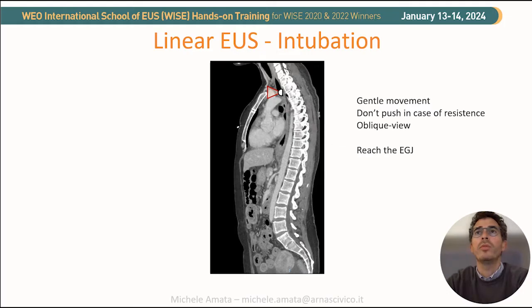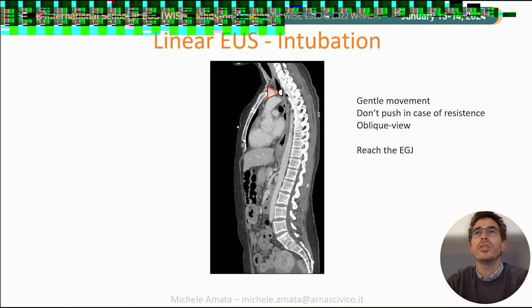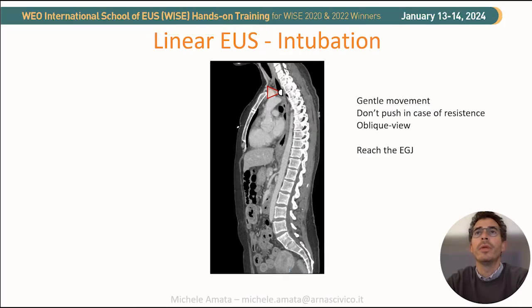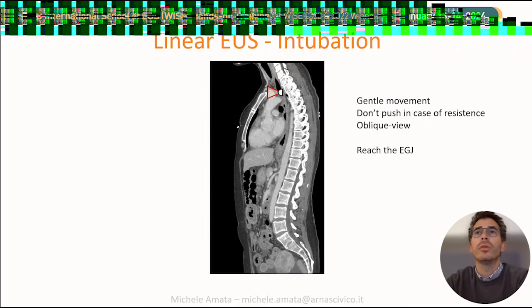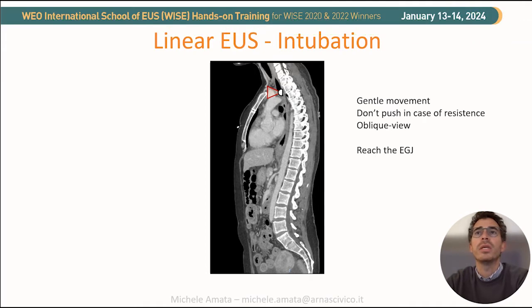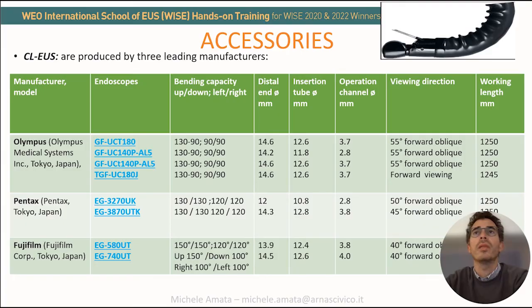We need to reach the EGJ junction passing through the mouth and the esophagus. We need to be gentle and not push in case of resistance, and keep in mind that our instrument has an oblique view. The angle of view will be slightly different depending on the manufacturer model.